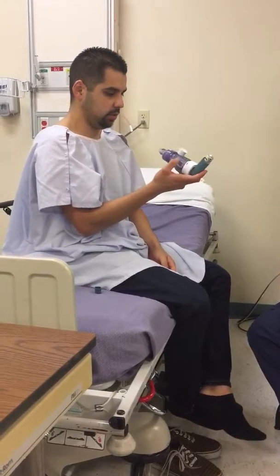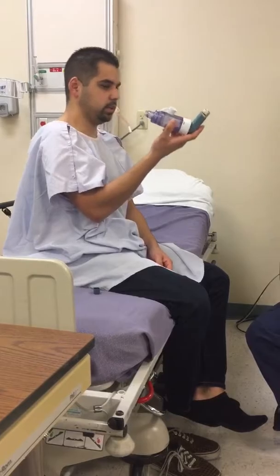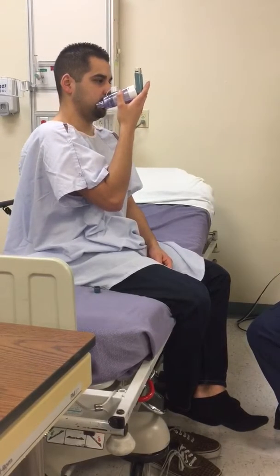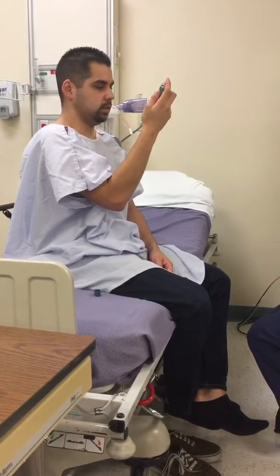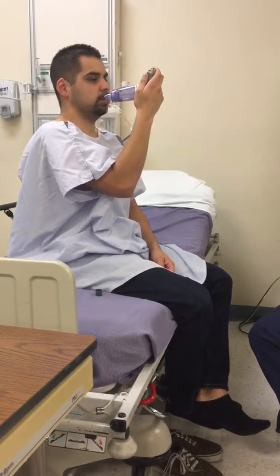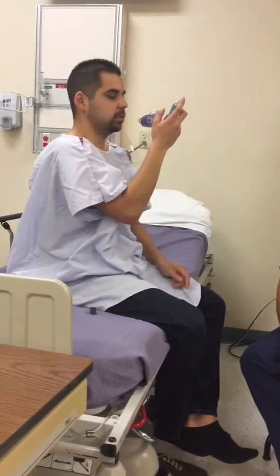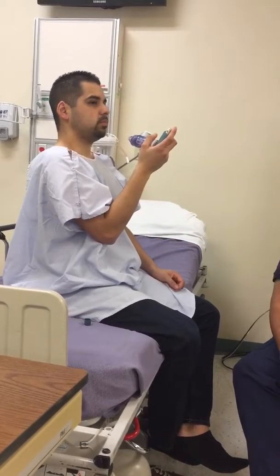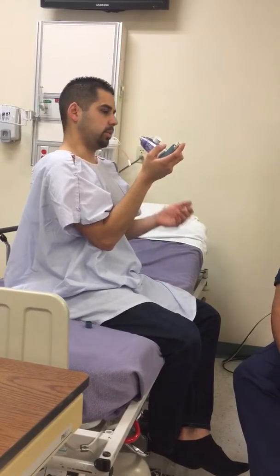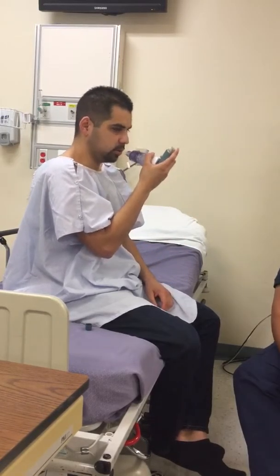Right. And then what I want to do is I exhale first, and then I tilt my head back. I wrap my lips around the device, and then I take my breath in. I don't have to push it because it's already in the spacer, right? Right. And then hold my breath for 10 seconds, and then exhale through my nose. Exactly. So when you're ready, do it.